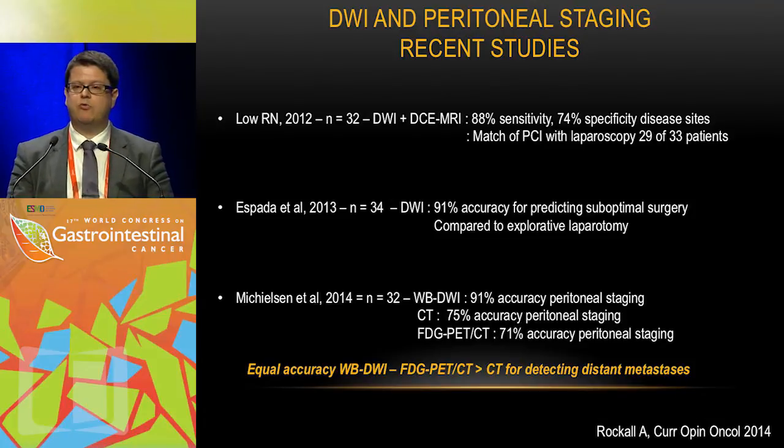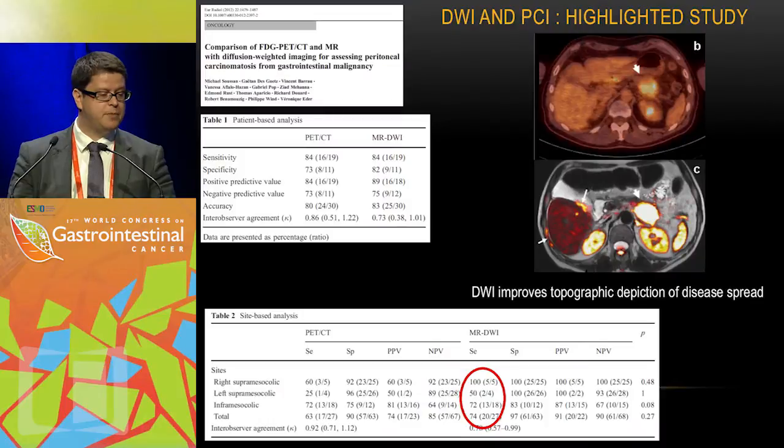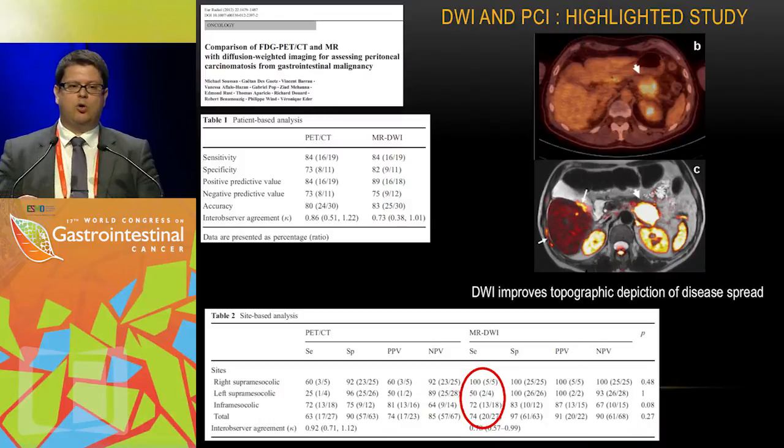And this is a study we performed with whole body MRI recently in ovarian cancer, where there was a very high accuracy for the MRI for peritoneal staging, higher than CT and PET-CT, but especially very important for nodal disease in the chest, the diffusion MRI was equal to the FDG PET for excluding nodal metastasis in the chest and the cervical areas.